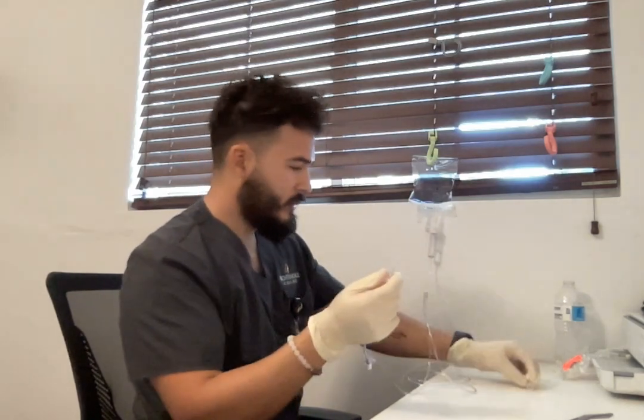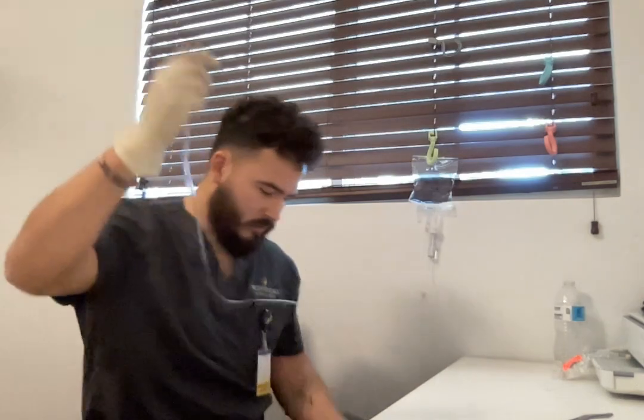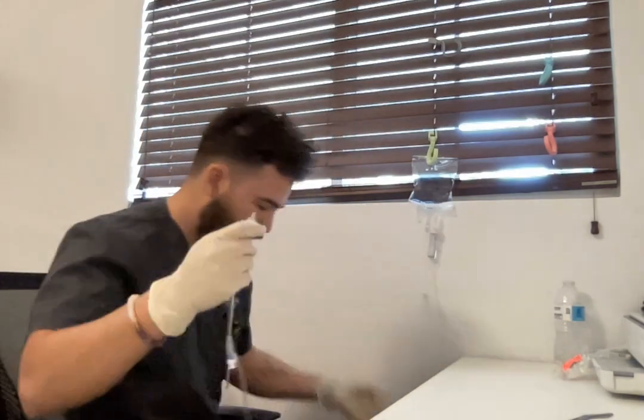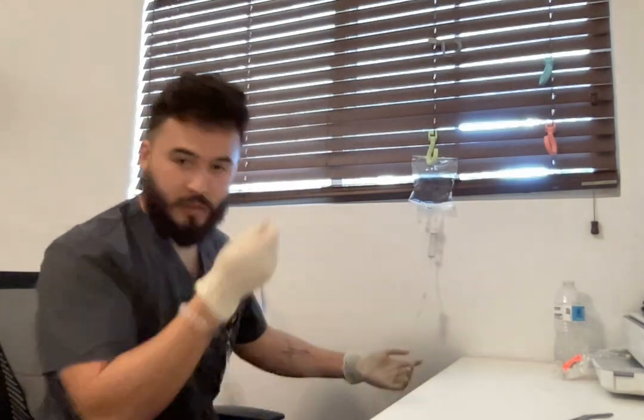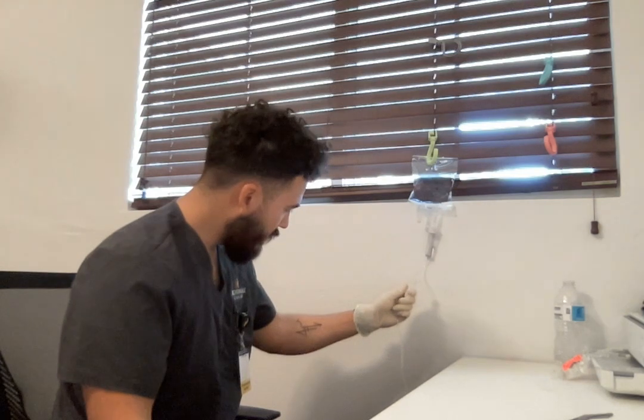The reason why we want to do this is because we want to actually remove the air from the line. So I'm going to stretch this all out and then put this in a garbage bag because water is going to come out. So let's do that.